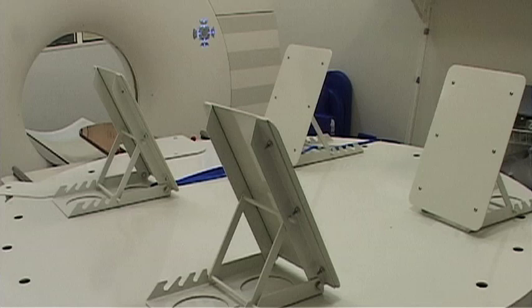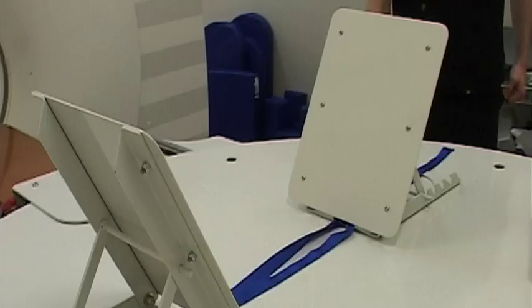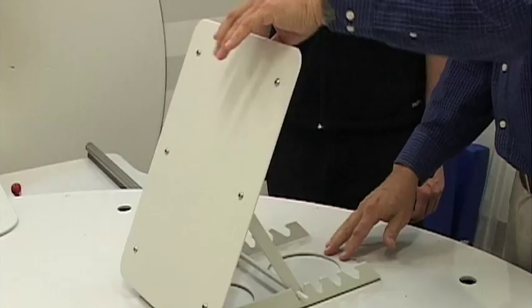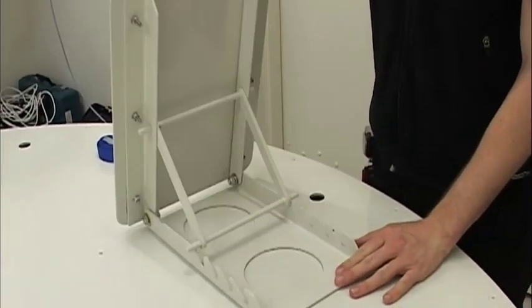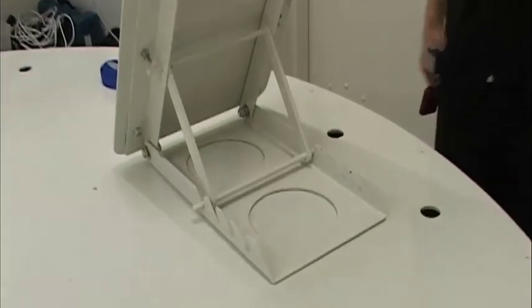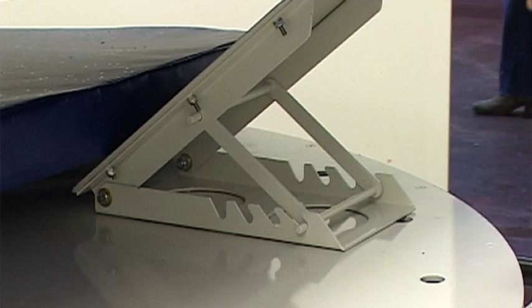To accommodate supine scans, the Equus CT has four adjustable body supports that are placed on the carousel on either side of the horse. They are quick and easy to put in place and are easily adjusted to the required angle to give maximum support to the supine horse, ensuring stable positioning throughout the scanning process.